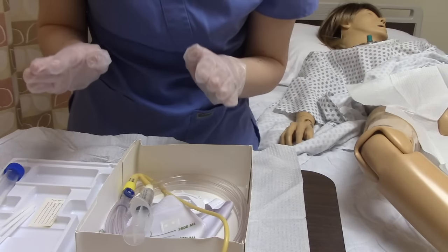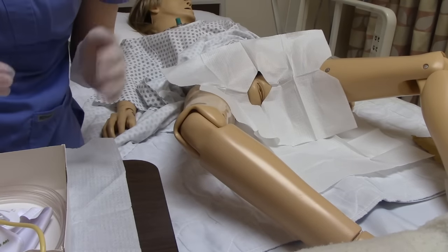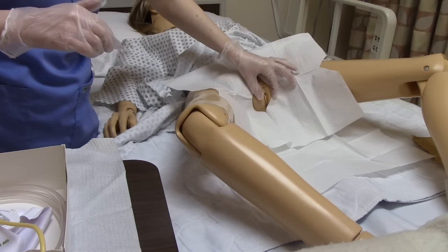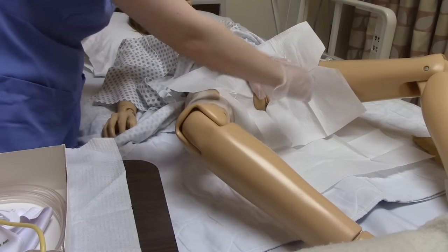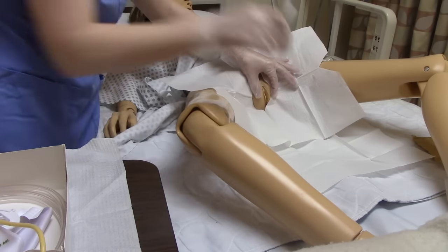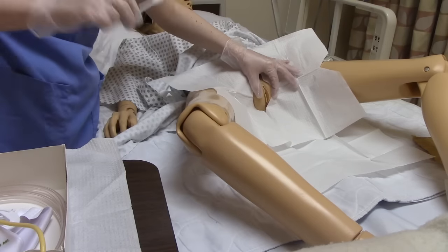Now we're ready to contaminate one of our hands. Since I'm right-handed, I'm going to contaminate my non-dominant left hand. This is a little bit trickier on a female patient because you have to hold the labia open with your fingers. We're going to hold it open, take one swab, and do furthest away from us first, then closest to us, and finally our third swab goes down the middle.